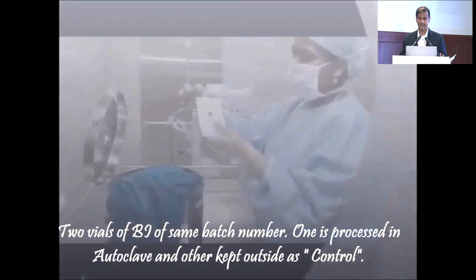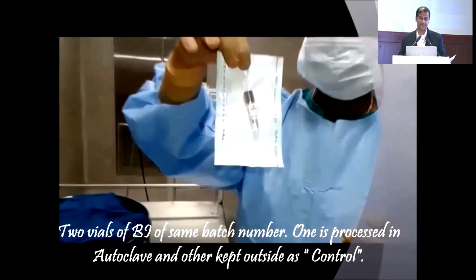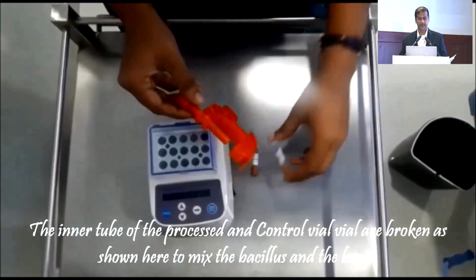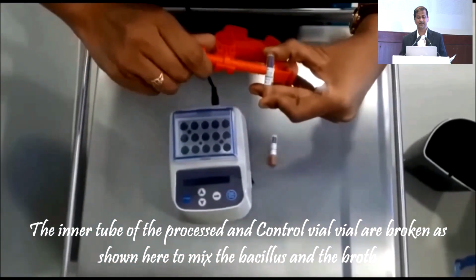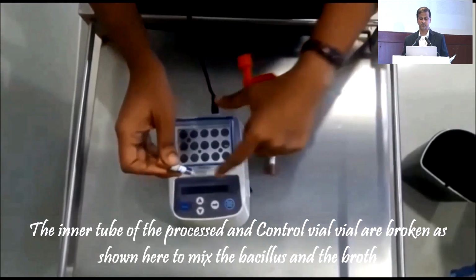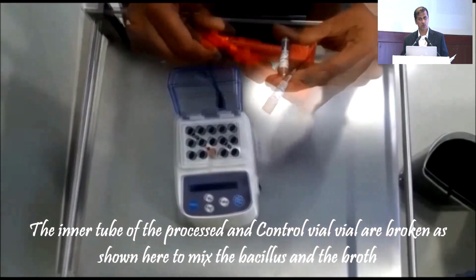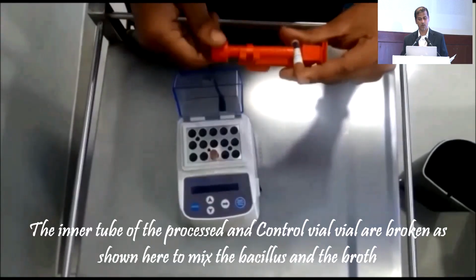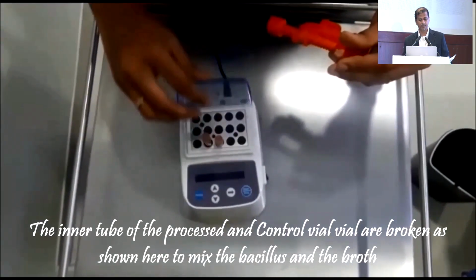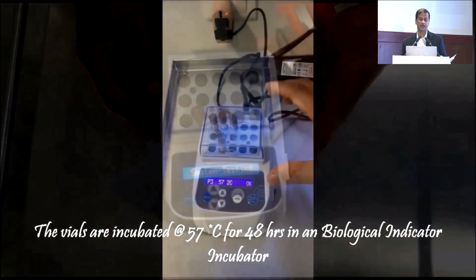One is processed inside the steam sterilizer and the other is kept outside. So after the sterilization cycle, this particular indicator is taken. As I told you earlier, the inside glass pipe has to be broken so that the Bacillus stearothermophilus mixes with the indicator. The unsterile one, which has not been sterilized, and the sterilized one, both are processed inside the biological indicator incubator at 57 degrees Celsius for 48 hours.